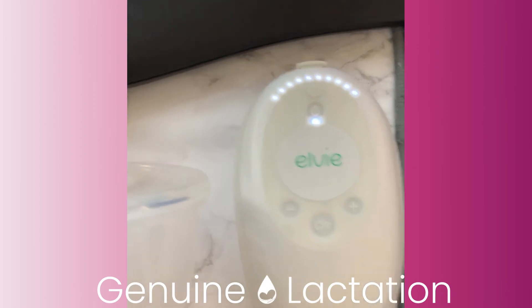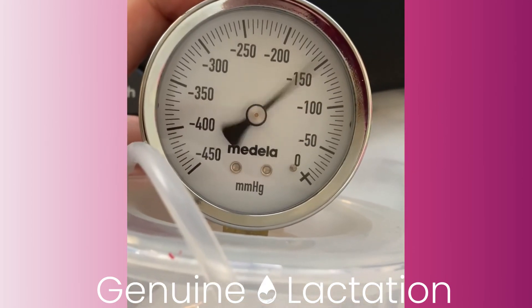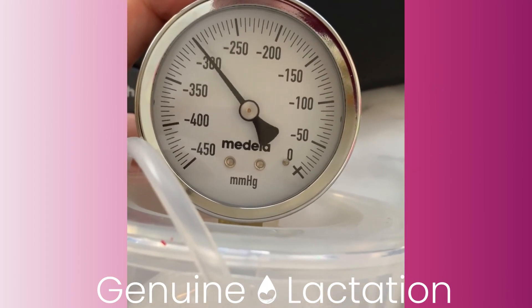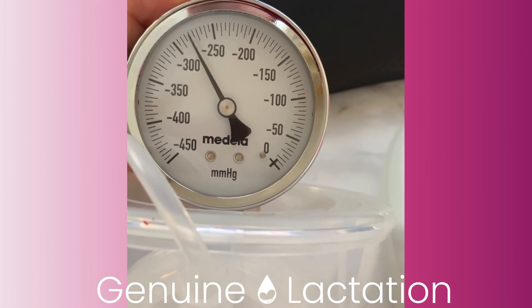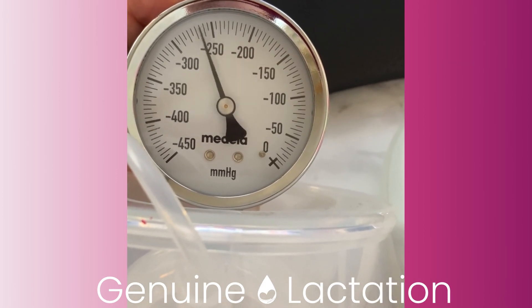This is the LV Stride with the Legendary cups, and you can see it gets up to 300 mmHg. So again, these different accessories work differently with this pump.